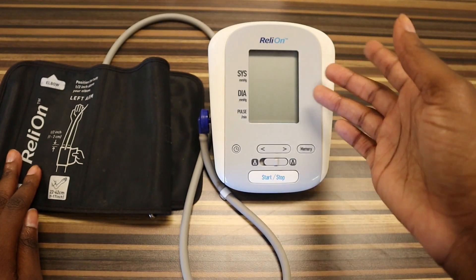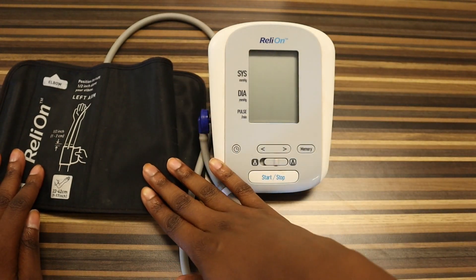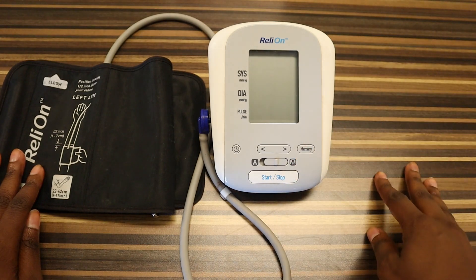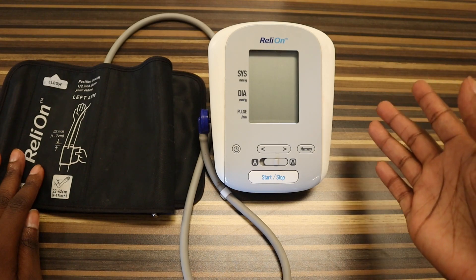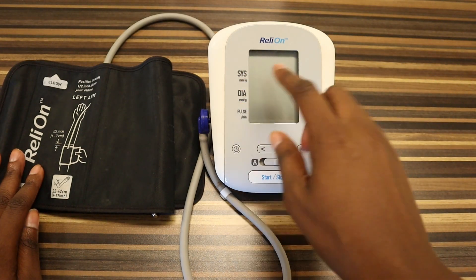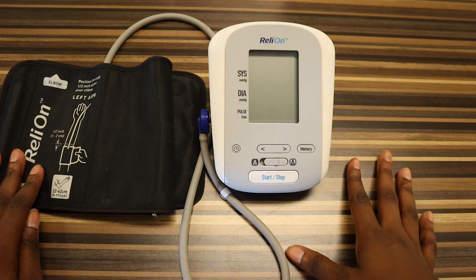When you're in the hospital it works exactly the same way — you put the cuff on the patient, press the machine to start, and in a couple of seconds it's going to tell you the patient's systolic and diastolic blood pressure. So now we're going to demonstrate how to take a blood pressure using this automatic cuff. I'm going to do the demonstration on myself.